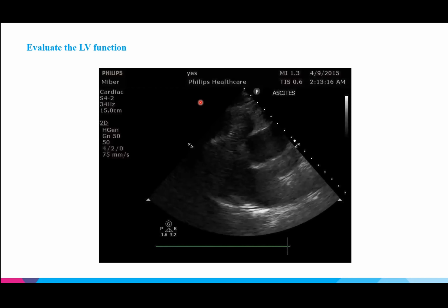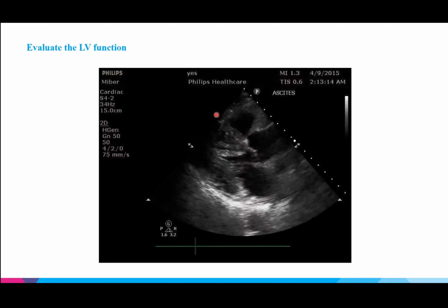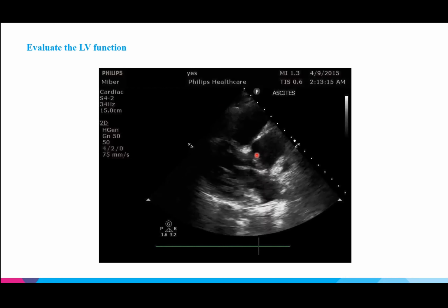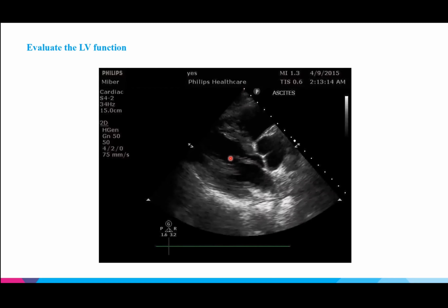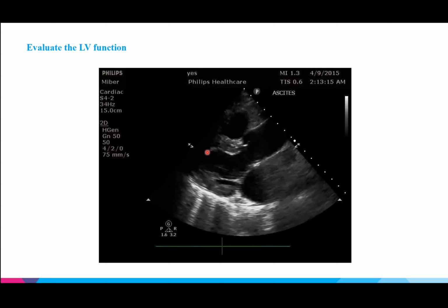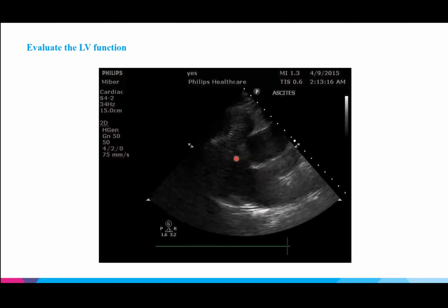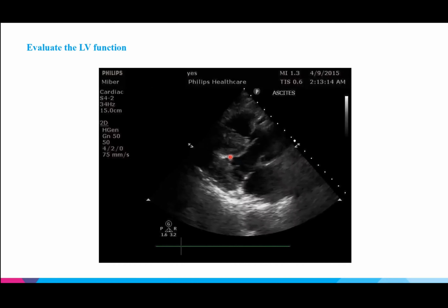And you can kind of tell we're in the thorax because this is part of some lung that's sliding in. So that's another tell. But I think this is definitely off axis. The structures are sort of twisted a little bit in a different way than we would normally see in a typical parasternal long axis view. And really with this view, what we're looking at, again, is the movement of the walls with contraction, right? The cavity is getting completely obliterated with contractions, disappearing. And then the anterior leaflet is basically touching the septal wall right here. So those are all signs that this is hyperdynamic function.